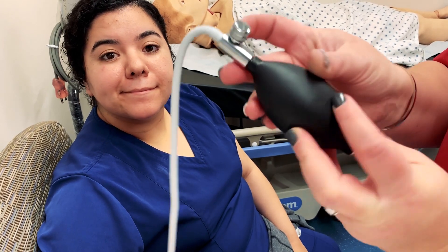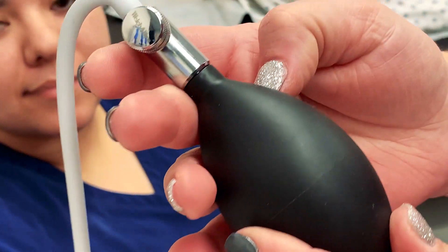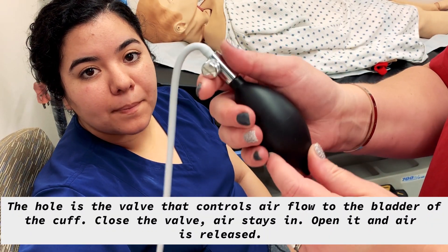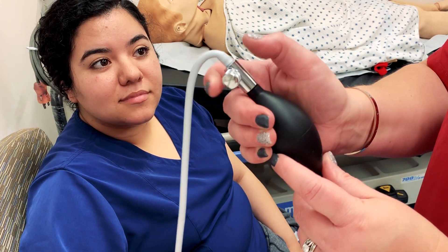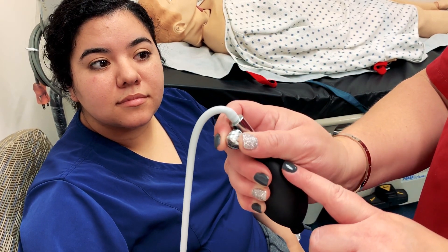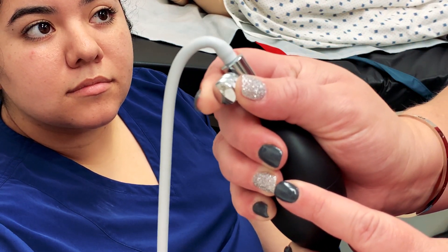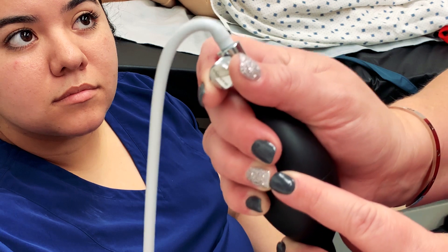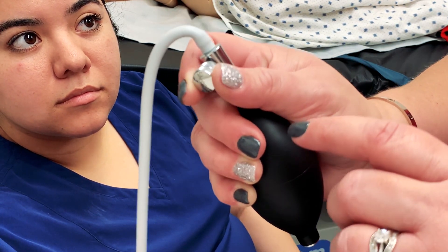There's a little hole underneath this dial, and that is what we are trying to close by rolling this valve all the way backwards. Then as we pump up, we open it by rolling this valve very gently, carefully, and slowly in small amounts forward. The more you roll it forward, the faster the air will deflate from the cuff after it is pumped up.